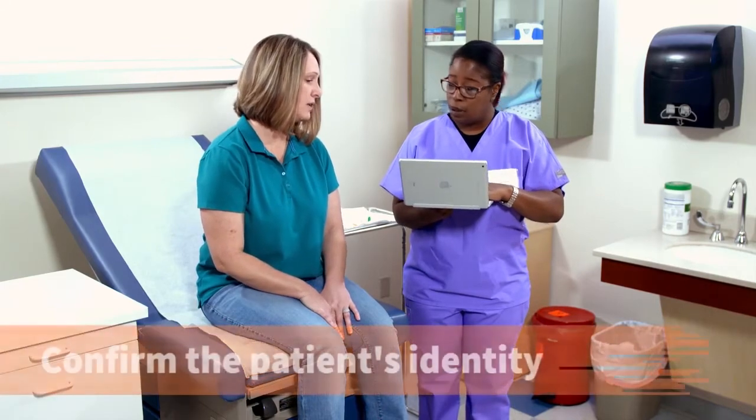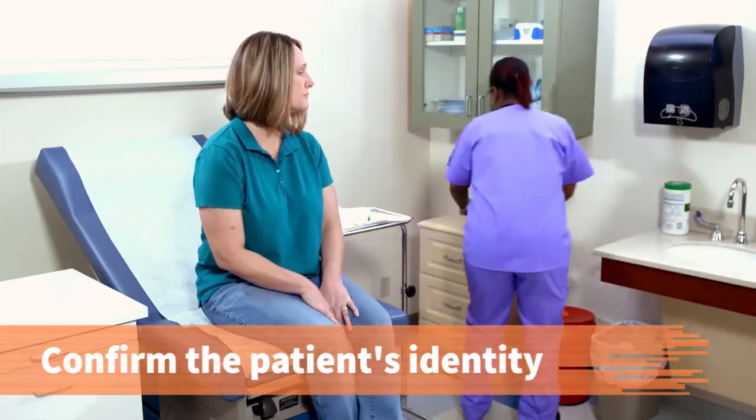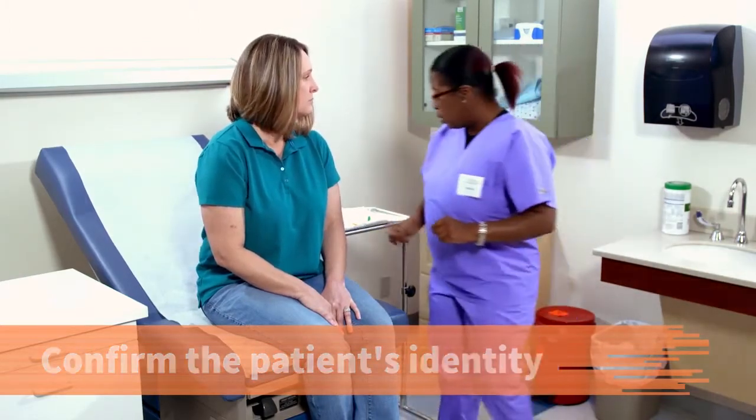I want to verify a few things with you. Okay. Can you give me your name? It's Tina Lakin. And your date of birth? 4/21. Verify the patient's identity with her full name and date of birth. Make sure the patient's information matches the order and the record.